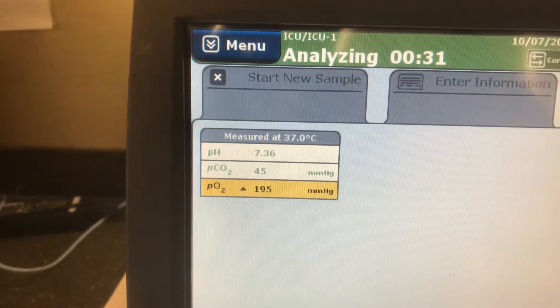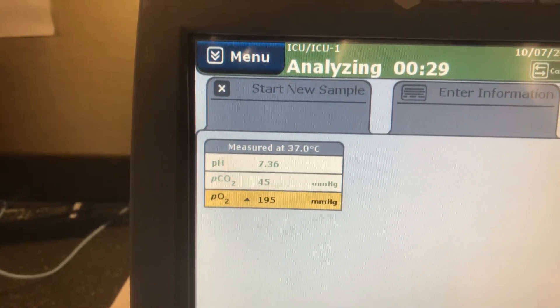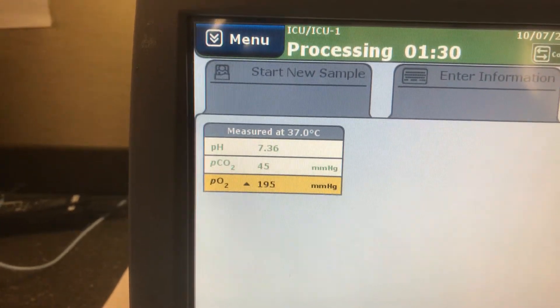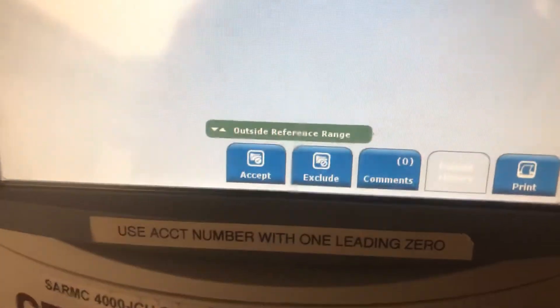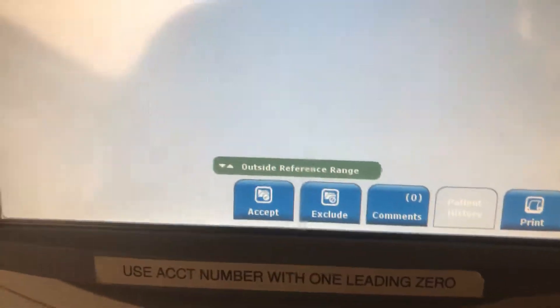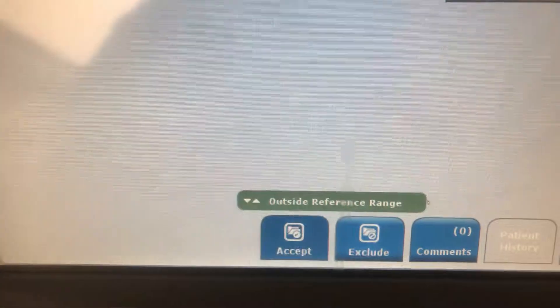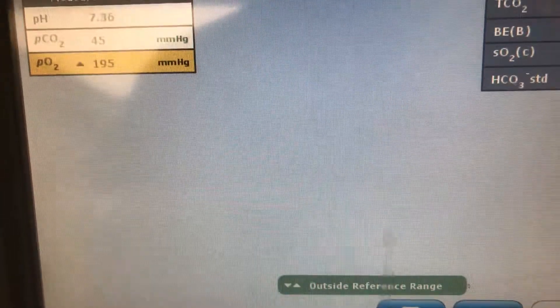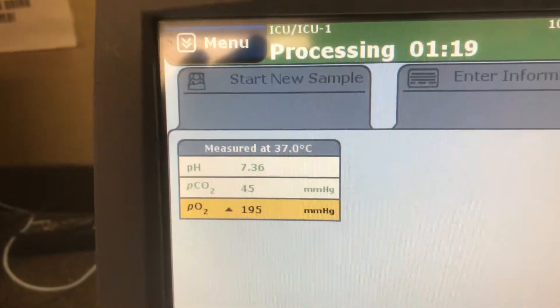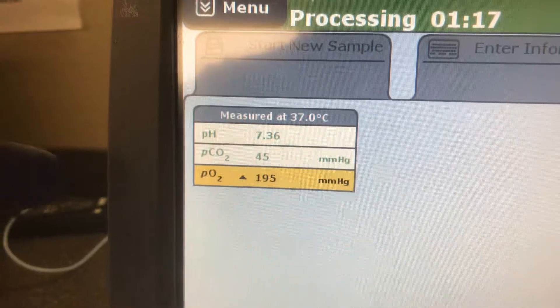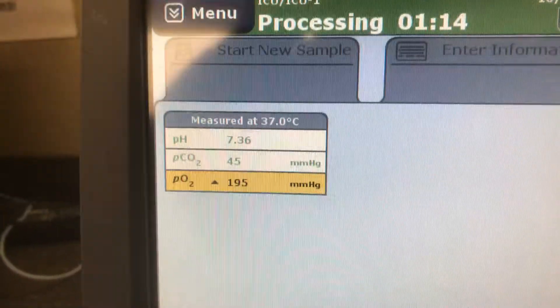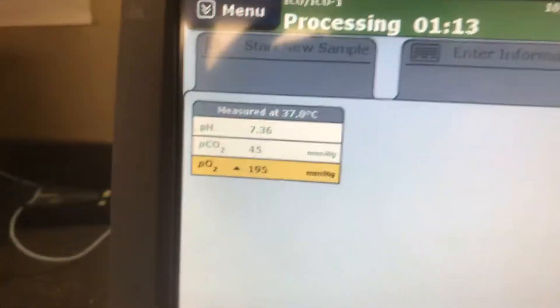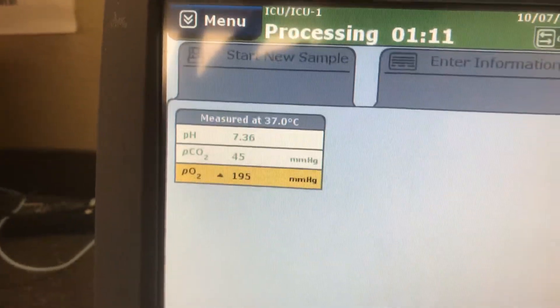Remember to put our critical values in the critical value sheet in PowerChart. Results are up, but we're not quite done yet — we have to come down here and hit the accept button. Once we do that, it'll send it off into the electronic record. Every ABG result where yellow is typically cautionary and red is a critical value, so you need to report that.